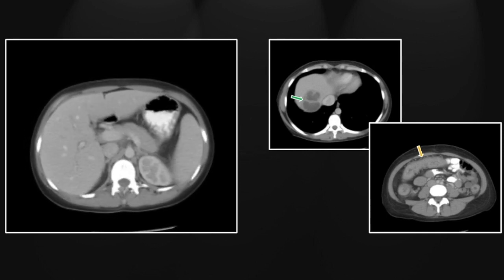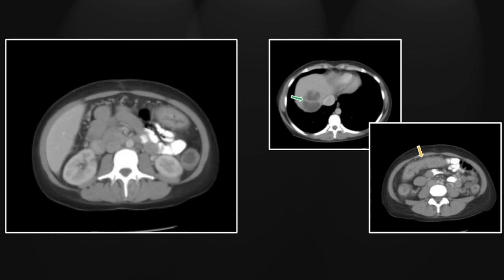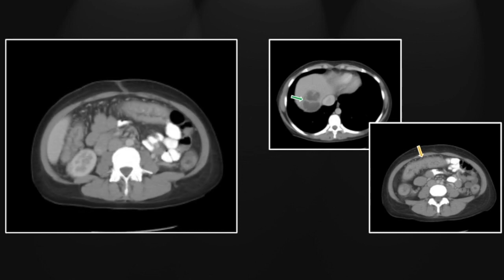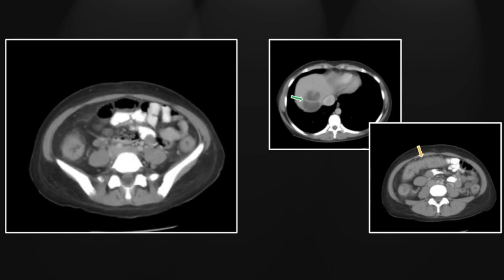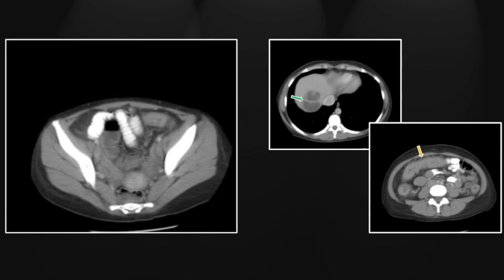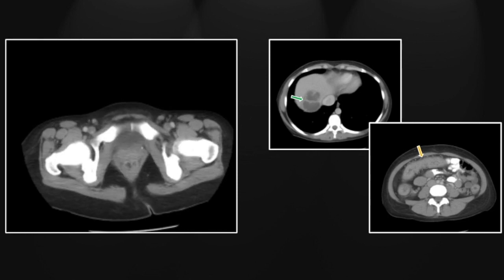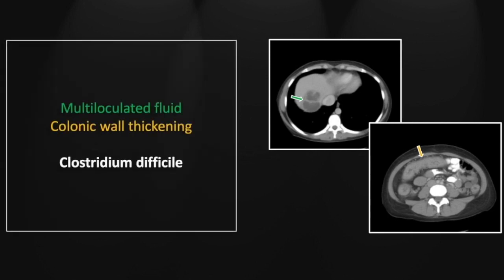But lower down, you can definitely appreciate the pancolitis involving the entire visualized extent of the colon, again highly suggestive of Clostridium difficile infection. So that is a pancolitis from C. diff causing a right hepatic abscess.